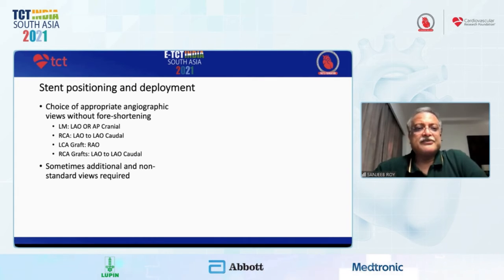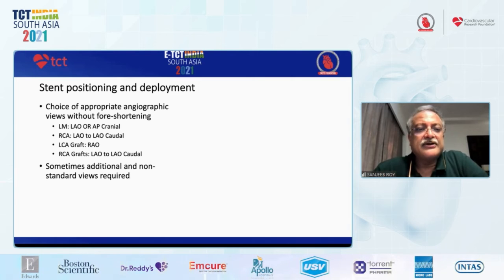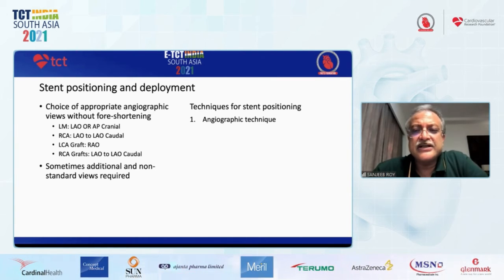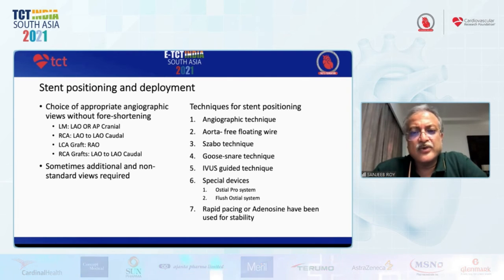When it comes to stent positioning, we must again appropriately profile the ostia without any foreshortening. Sometimes additional or non-standard views might be required. Stent positioning most often is done in angiographic view, but other techniques are also there. I'll quickly go through them.